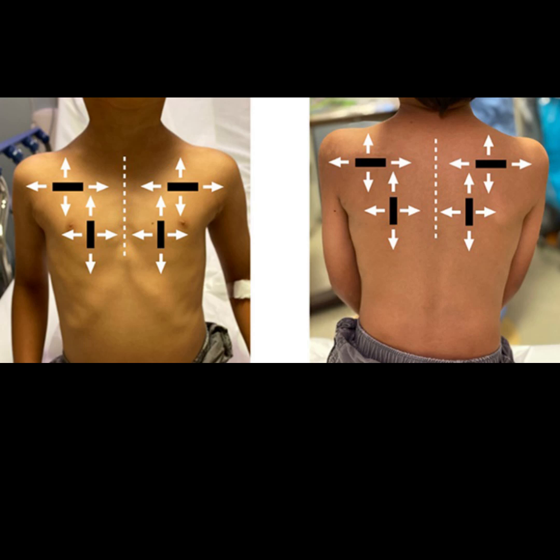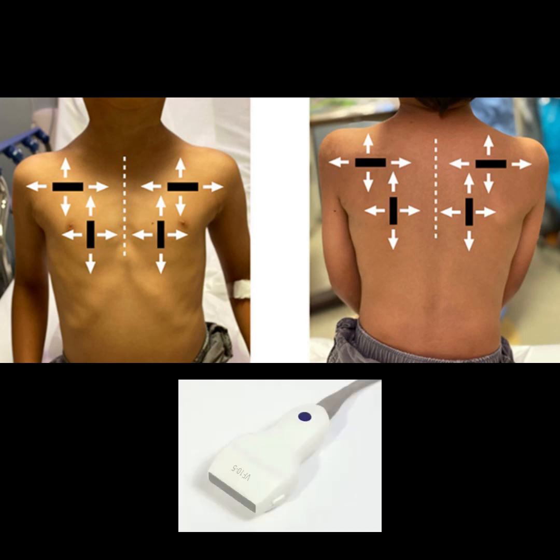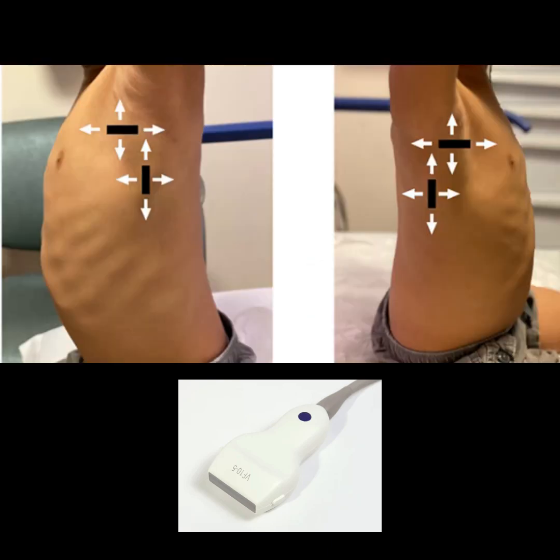In this video I'm going to be showing you lung pathology that you can and will find using POCUS. For this we would have the child sat on the carer's lap or bed. We would use the high frequency probe, providing us with the best spatial resolution but limited depth. We would be scanning anteriorly and posteriorly in a dynamic fashion, trying to cover as much of the lung as we can, from medial to lateral, and never forgetting to scan into the axilla.